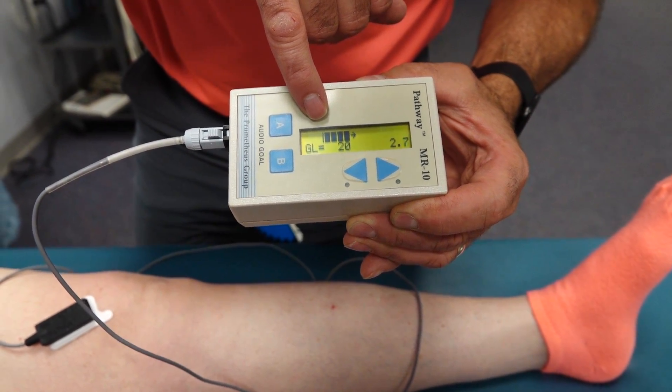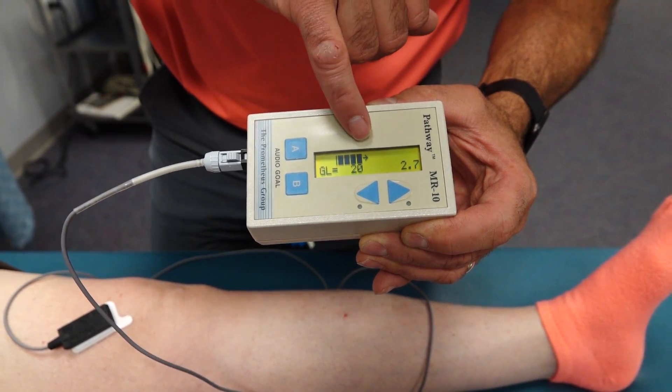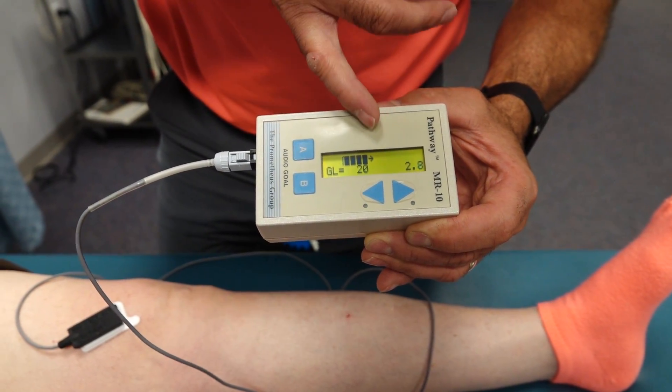And as she tightens up, you'll notice that the bars are going to go toward the arrow. Once you hit the arrow, it's going to beep, and that'll give her that biofeedback.